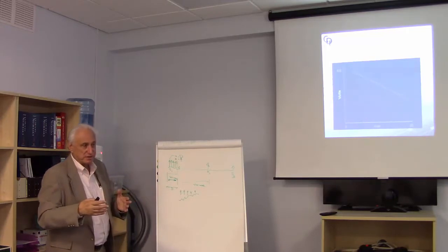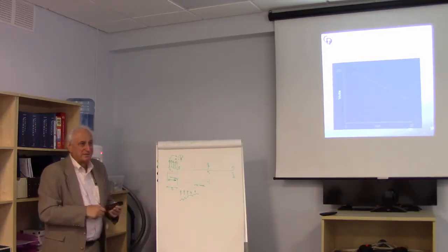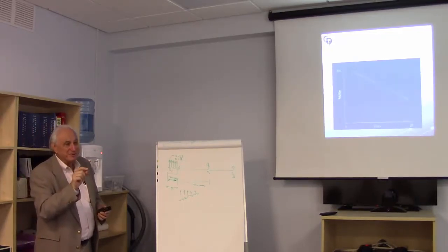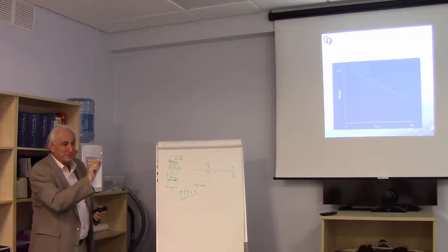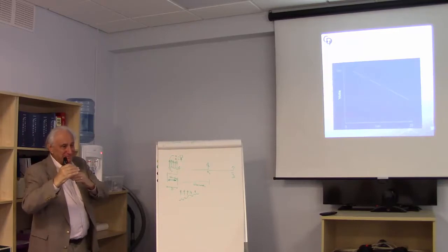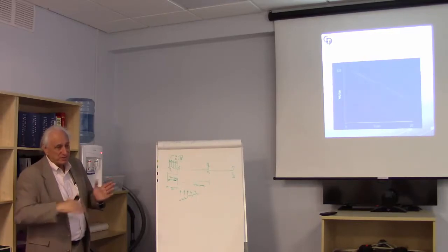I was thinking about changing resistance and impedance with the skull and scalp. Well, I'm sure that if it's smaller, it should be thinner. It should be the other way. Yeah, I know, it should be the other way if you think about it strictly from that electronic viewpoint of the skull. So this, I think, has to do with the maturational effect.